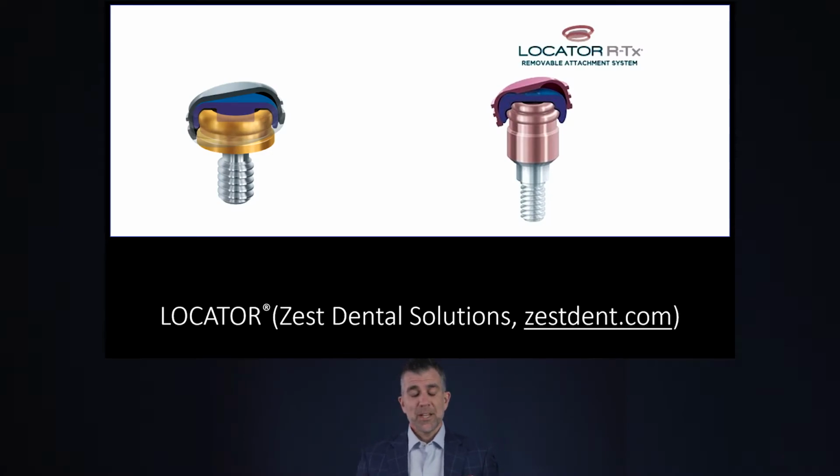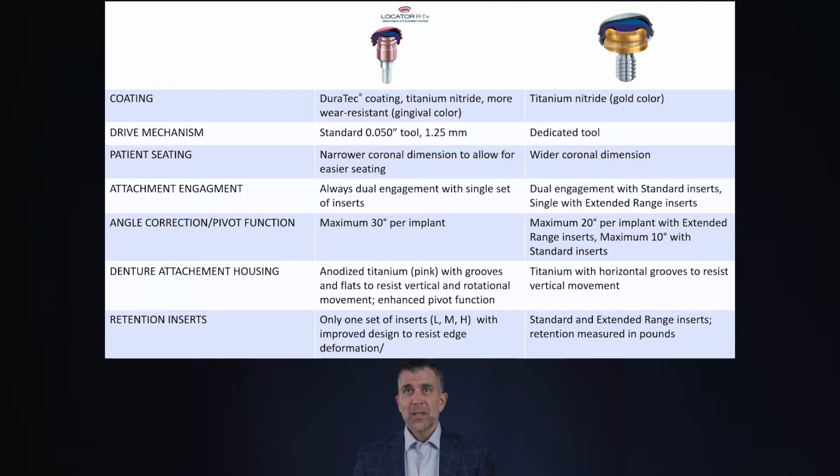Zest has been the manufacturer of locators for a number of years, and they're kind of the monopoly in this area. But they have the Legacy locator, and recently they've introduced the Locator RTX. And rather than read to you all the differences in the Legacy locator versus the Locator RTX, I'll point out a few that I find really made some profound impacts on providing locators as a retentive element for dentures.